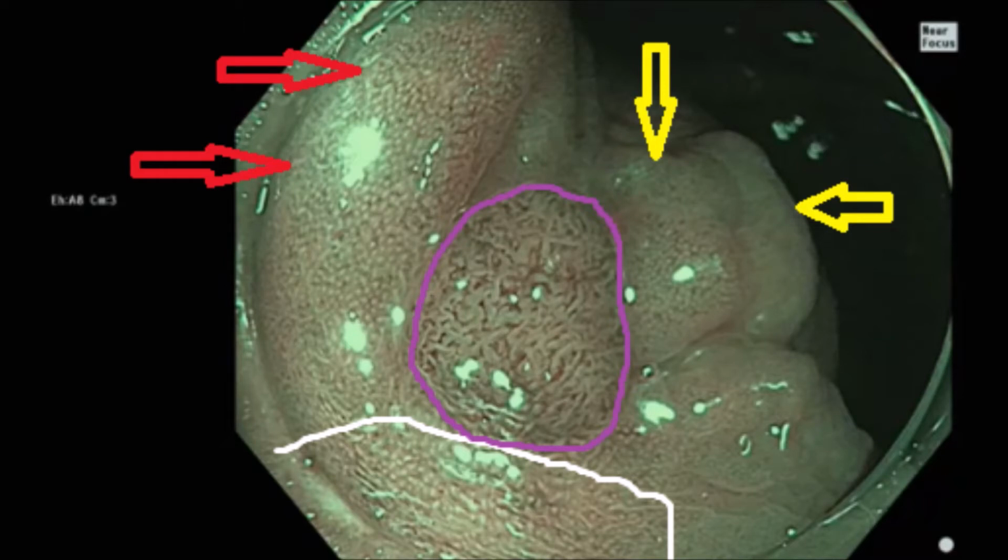All of the brown lines within that purple circle are blood vessels. They are surrounding white structures that are long and tubular. This is obviously NICE 2 or Kudo 3L. So this is the recurrence and it's the target.